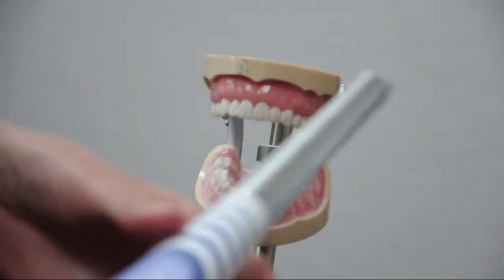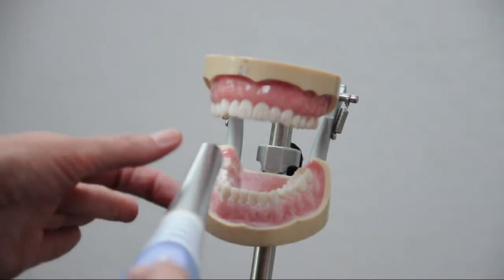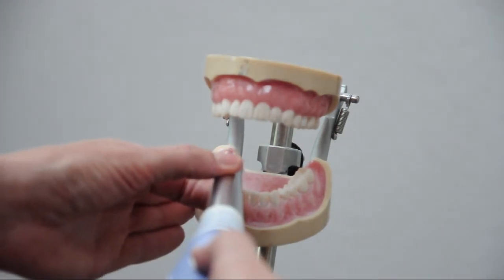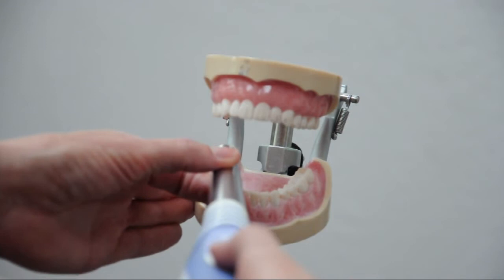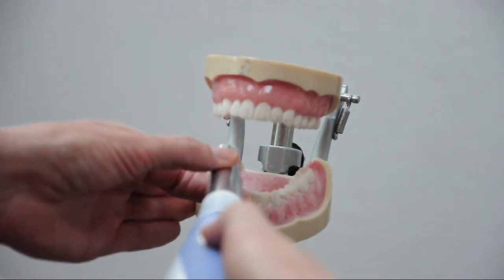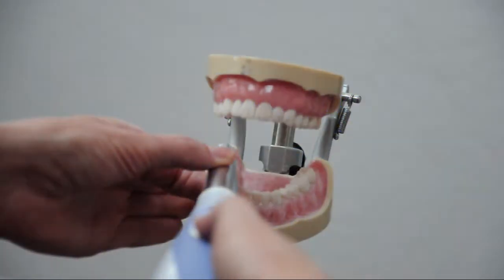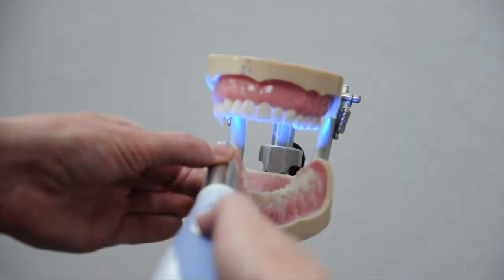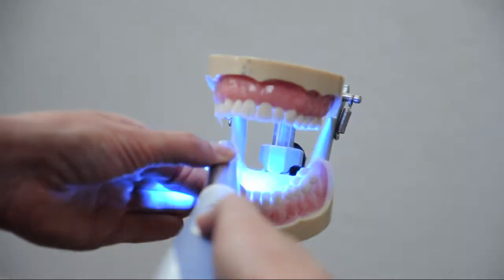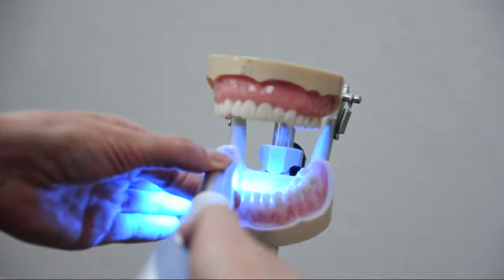We're going to go ahead and show you a quick demo here of the 3D video technology for digital impressioning with the Lada COS. I have the wand here which I'm going to position over the teeth. When I line this up, I'll have my image on the screen within the triangle. That's my view box which will show me what I'm capturing.